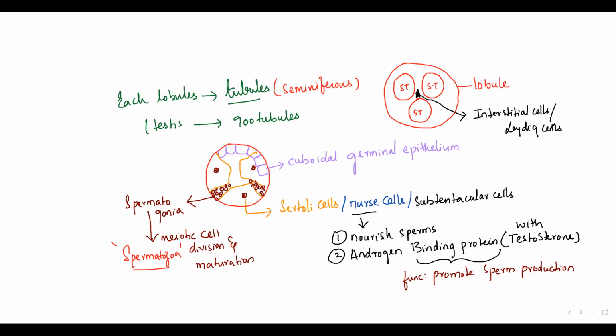Children, these Leydig cells secrete the male hormone called testosterone. This is important for us to understand. So these Leydig cells work like endocrine cells.